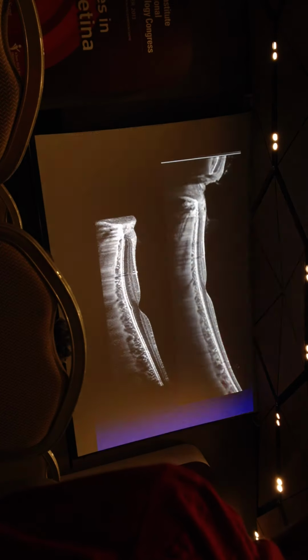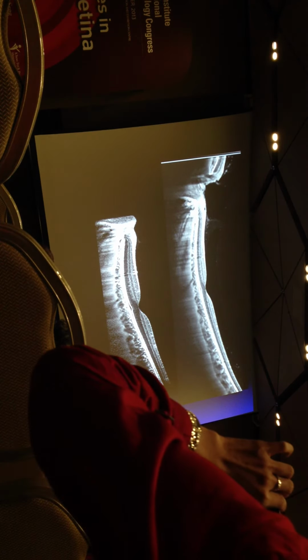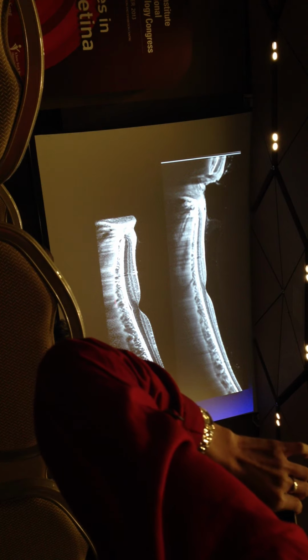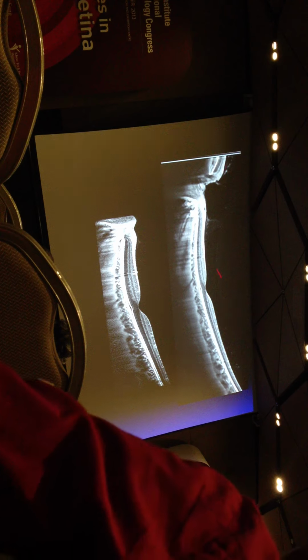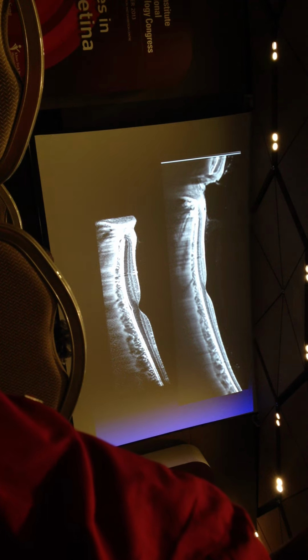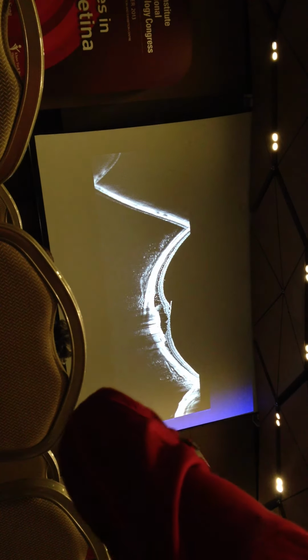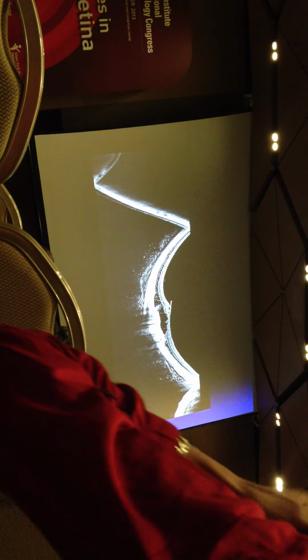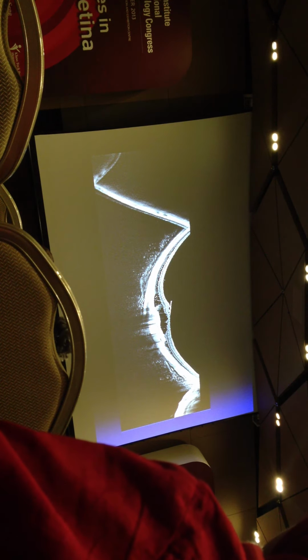staphyloma. And this is just an example from one of our own patients where the spectral domain OCT shows us the choroid. This is an EDI scan, but we don't really see the rest of the findings above. And of course, posterior vitreous detachment is more common in myopes. Just to point out that sometimes even using the swept source OCT, you can get this artifact. So it's not entirely a magical solution to this.